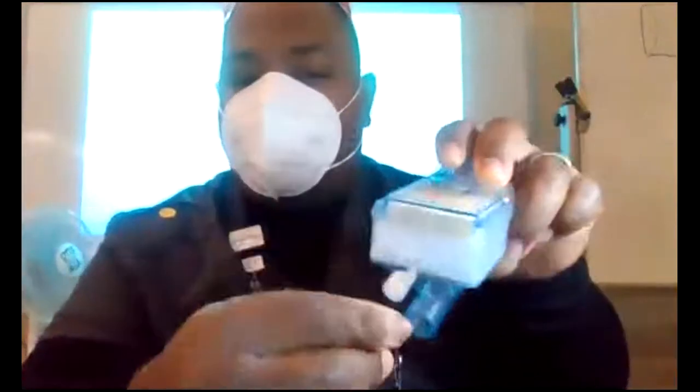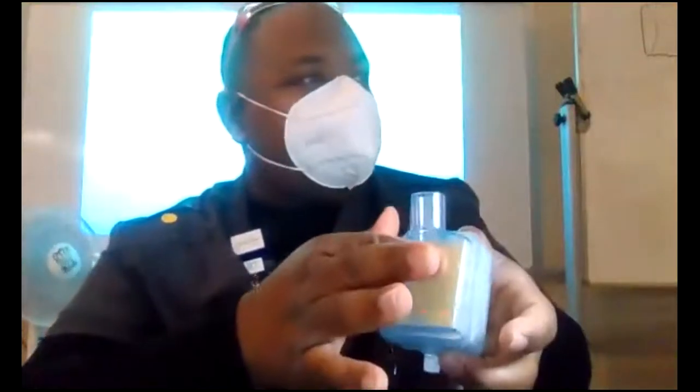They have a little spigot here that will collect secretions. If this gets moist and starts getting secretions, it will leak down into this, and they can pop that off, put the suction catheter on there, and suck that stuff out. If you have a whole lot of secretions and it gets real bad, you can't use this, because it's going to start blocking up. If it's all clogged and full of yellow secretions, you have to toss it and get another.